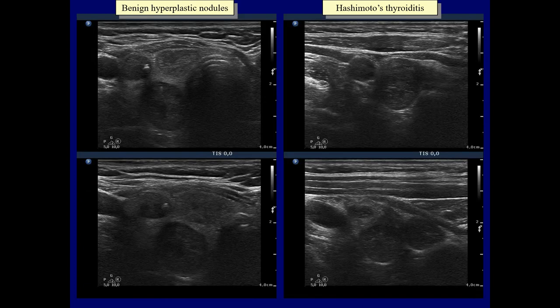Nevertheless, being the lesion a nodule in a pathological sense seems more likely than the opposite. The limitations of ultrasonography are demonstrated with these cases. Although we can find small differences, the sonographic presentations are very similar; multiple discrete lesions are presented in an isoechoic background. On the other hand, the Hashimoto's case presents fibrosis and hypoechoic areas outside the discrete lesions.